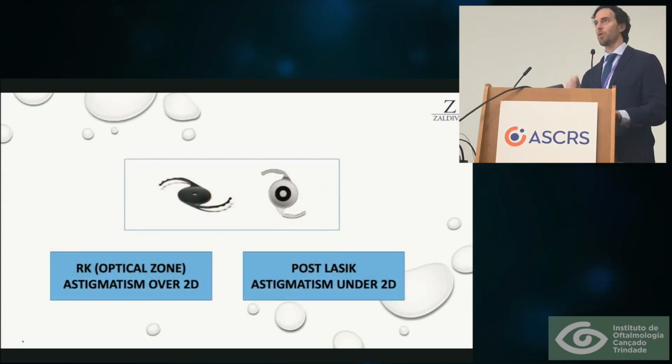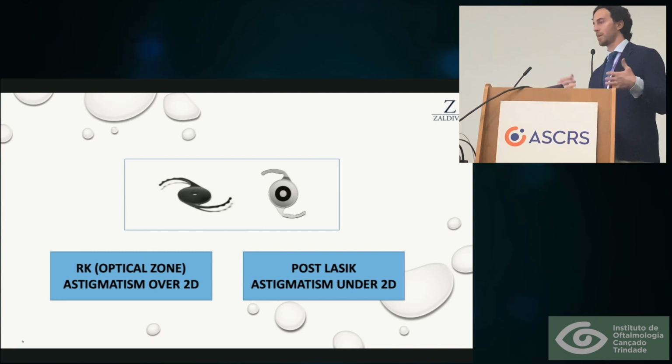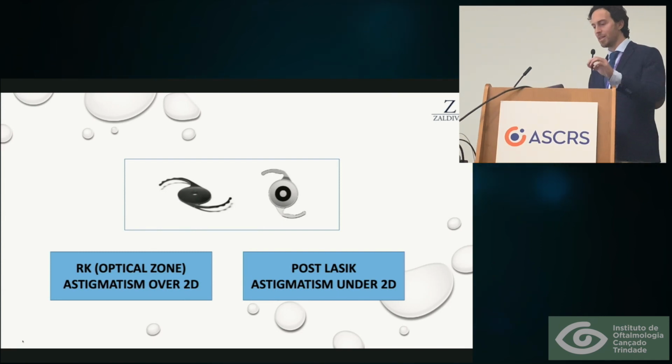So let's go to your point. We have two small aperture IOLs available today. One that includes power, and the other one that has been widely discussed today that sits in the sulcus. Which are the differences and what do we do in each, which is the strategy?